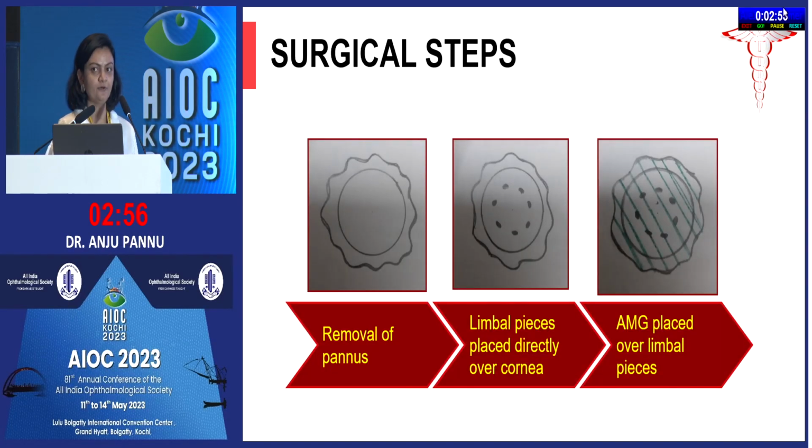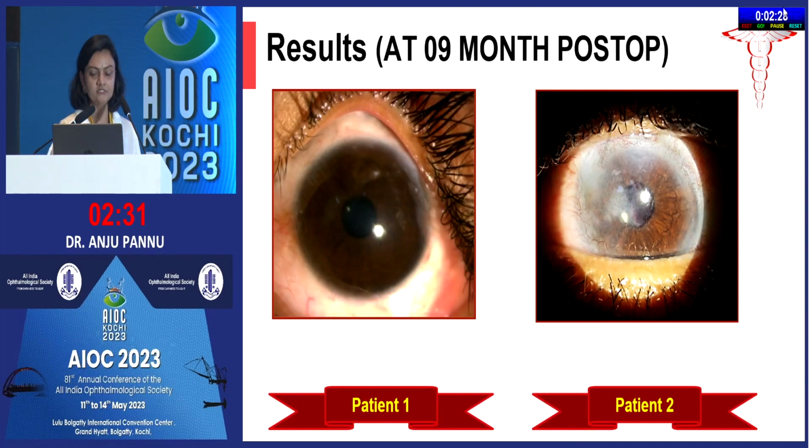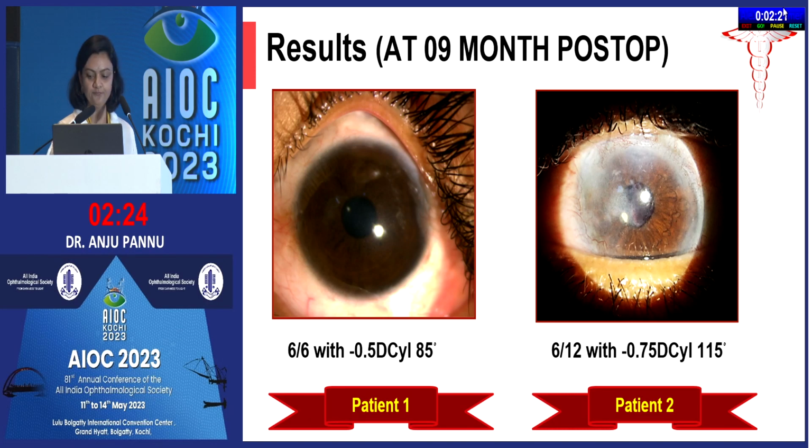The initial step of harvesting the limbal tissue was the same as the conventional SLET technique, but on the recipient eye, initially the pannus was removed and then the limbal tissues were placed over the concerned area. This diagram is actually showing the whole cornea, but in these cases, the limbal tissues were placed over the concerned area and then the AMG was placed. Since case 1 also had the symblepharon, we used a conjunctival autograft in that area. The results were comparable to the conventional SLET technique, with good visual acuity at 9 months post-op.